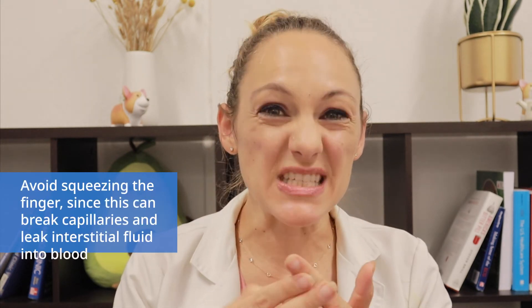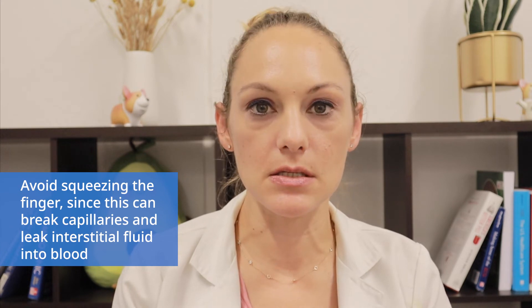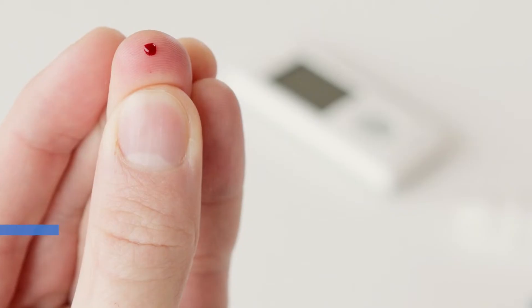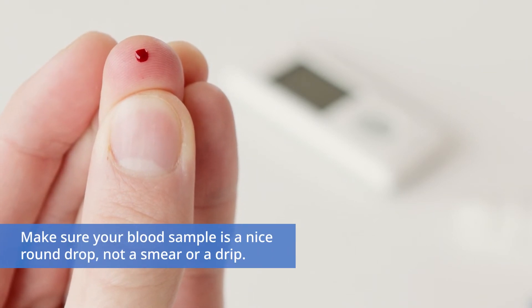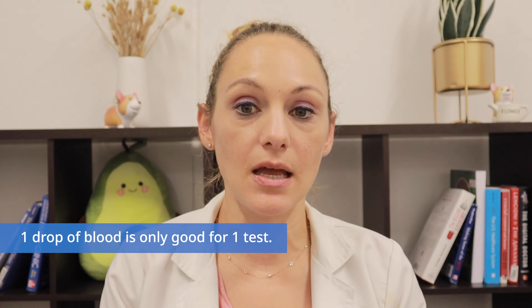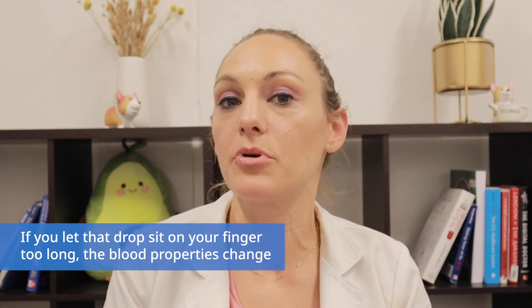To collect a blood sample, first gently massage from the bottom of the palm or the finger to get the blood out. Avoid squeezing your finger since this can break the capillaries and leak interstitial fluid into the blood, causing a false low reading. Second, make sure your blood sample is a nice round drop, not a smear or a drip. The third thing to remember is that one drop of blood is only good for one test, and if you let that drop sit on your finger for too long, the blood properties change.